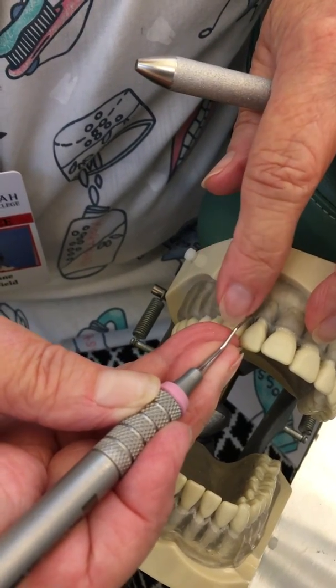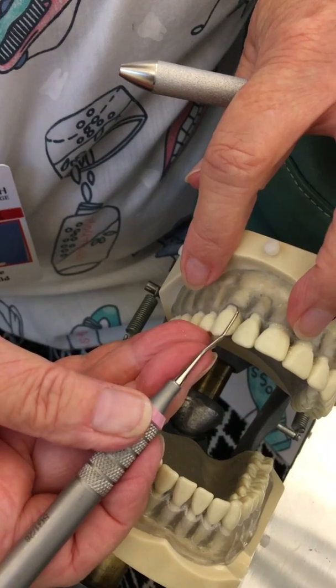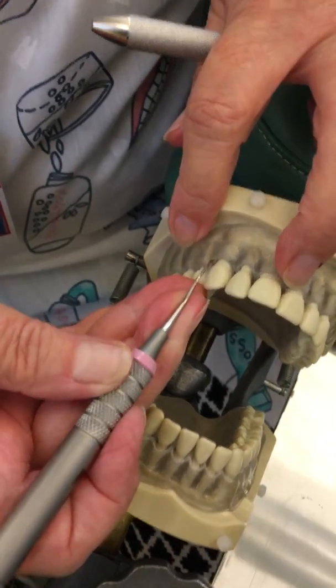As I come around the corner, I want to make sure my shank is parallel with the long axis of the tooth. Toe on, heel off.